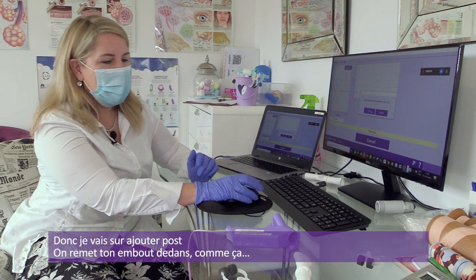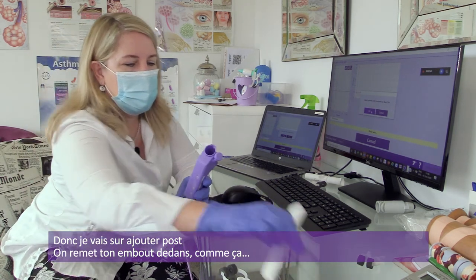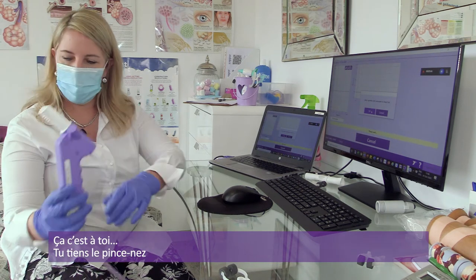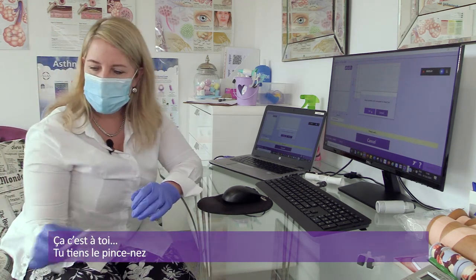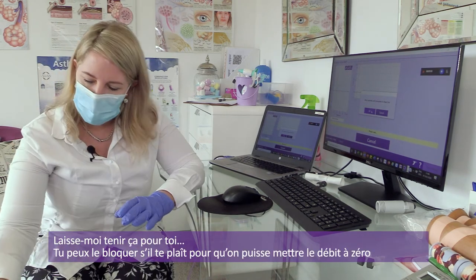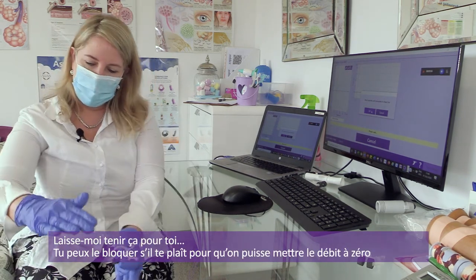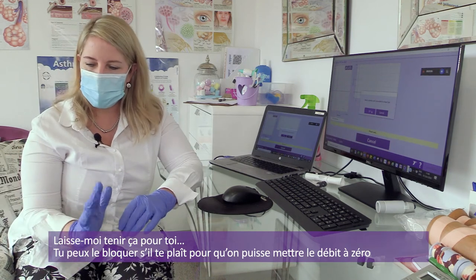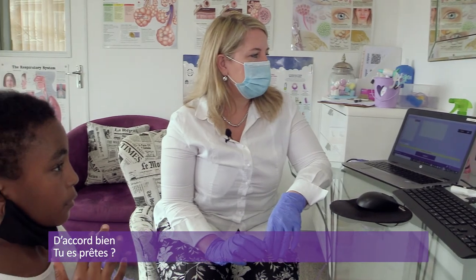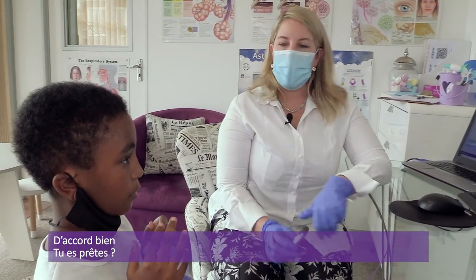Right. Okay, so let's put your piece back in here like that. All right, that's yours. And here's your nose clips. You can just hold those. All right, Shanti. Okay, so to start with, let me hold that for you. Can you block it, please, so that we can set the zero flow? All right, good. All right, are we ready?